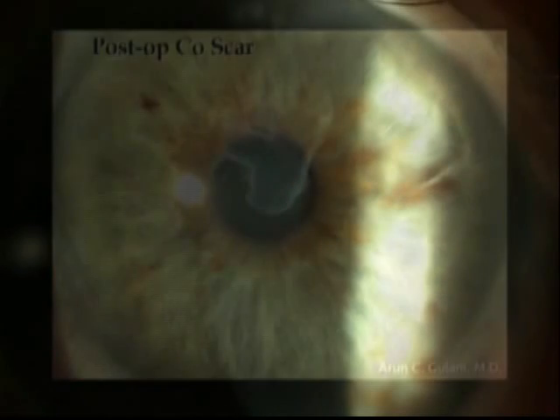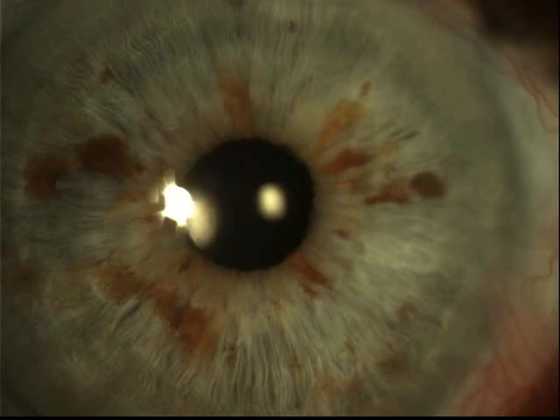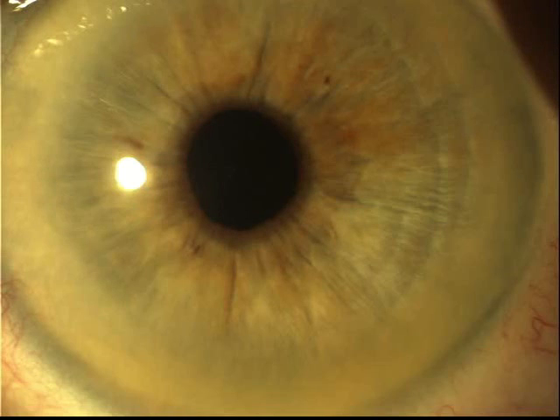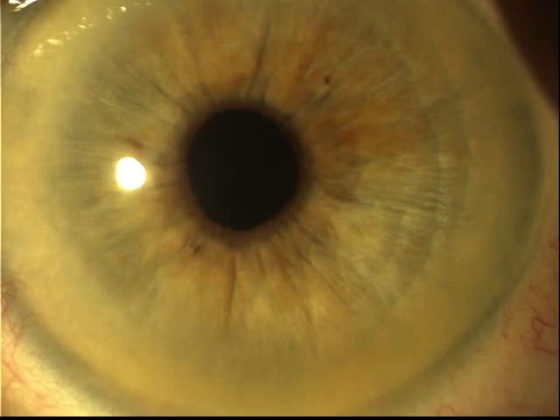Understanding on-corneal and in-corneal scars is key. This is a case of an on-corneal scar that followed laser scar peel followed by laser PRK to 20/20 vision. This is an in-corneal scar which underwent straight laser PRK to 20/20 vision, including central clarity.